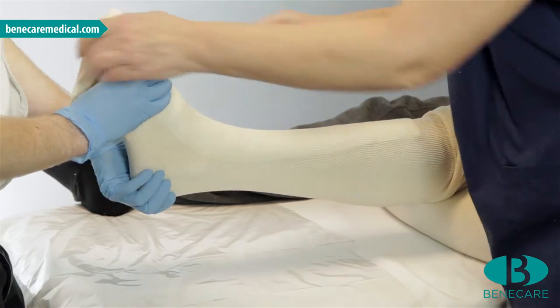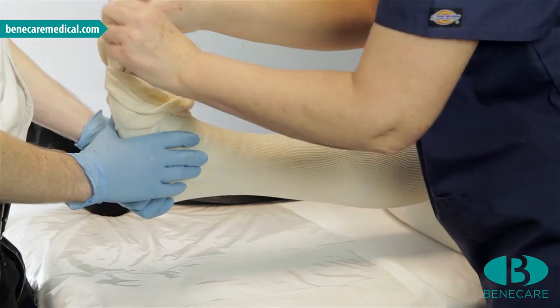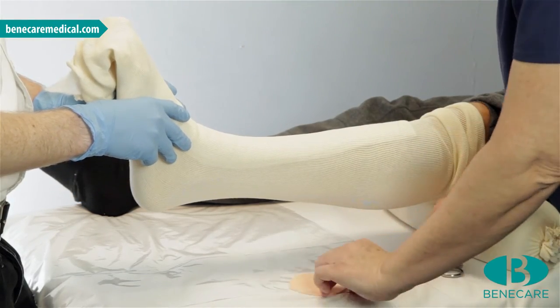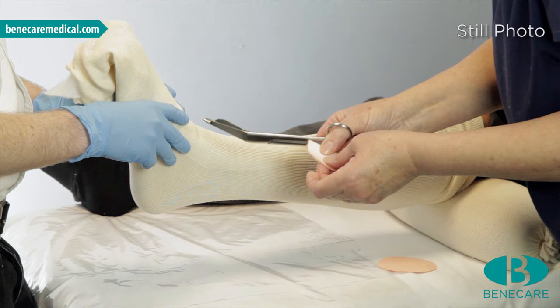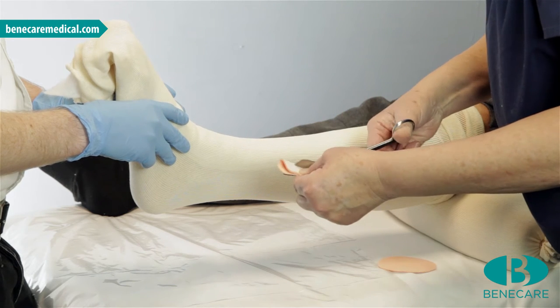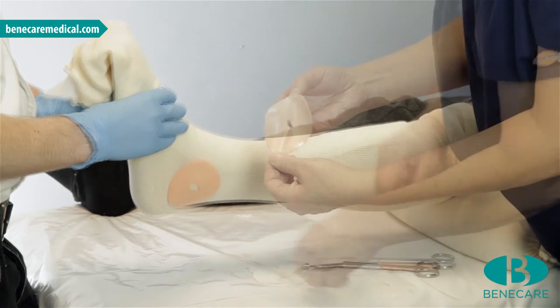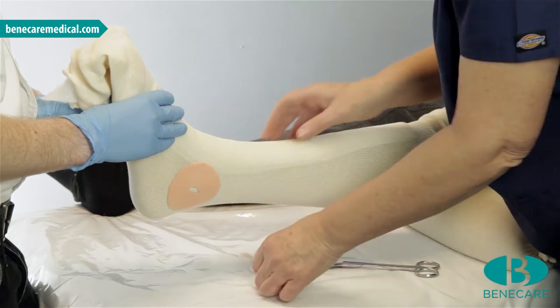This technique follows the principle of total contact casting with no conventional padding, so additional adhesive felt padding is required over bony prominences and vulnerable areas. Using the Benecast synthetic undercast padding, apply a double layer longitudinally to the anterior aspect of the limb — this will assist in the safe removal of the cast. I have pre-cut two circles; I will now cut a small hole, therefore offloading the pressure from the bony prominence. The areas that often need protection include the malleoli, base of fifth metatarsal, hallux valgus and head of the fibula.